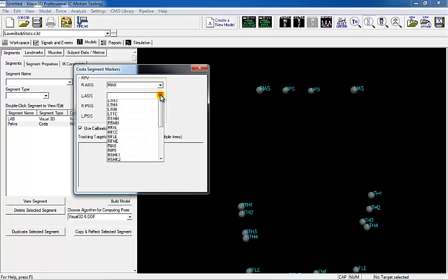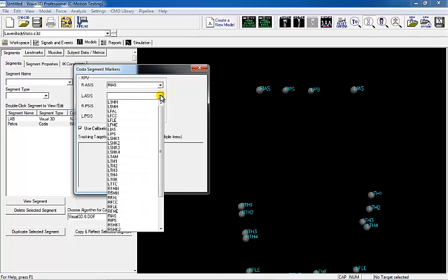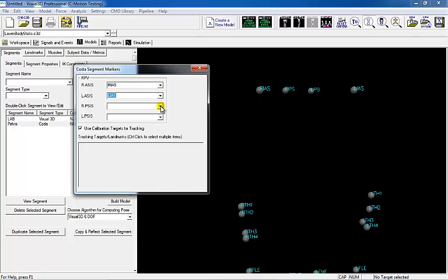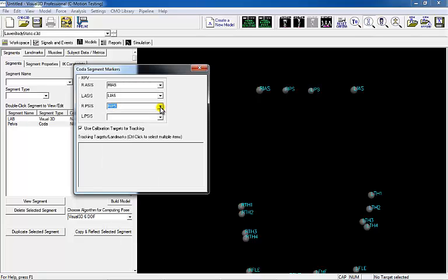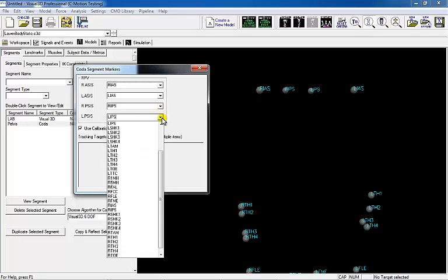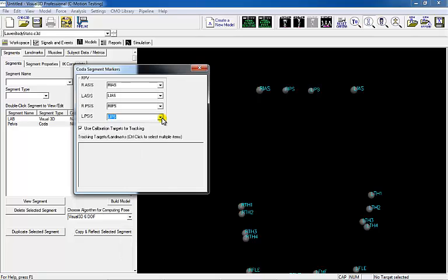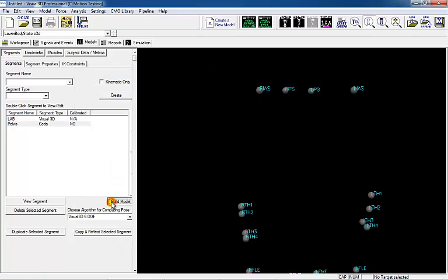Body mass and height are specific to each subject and will need to be changed for individual subjects. Select the correct ASIS and PSIS target IDs. If PSIS target IDs are not used and only a sacrum marker is used, enter the sacrum target ID into both PSIS option boxes.